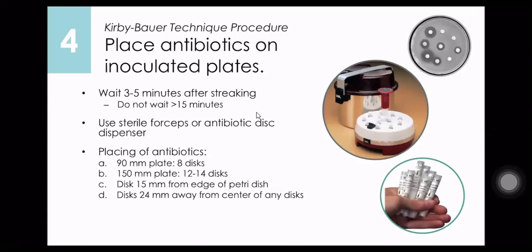However, if there is a delay of 15 minutes before the incubation, there is false sensitivity or false susceptibility in the results. So if your organism dries out, there is a tendency for false resistance. However, if there is a delay in incubation, there is false sensitivity.